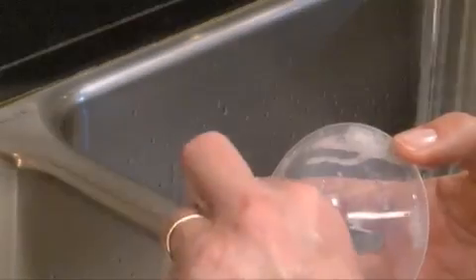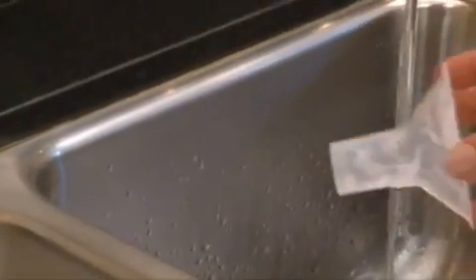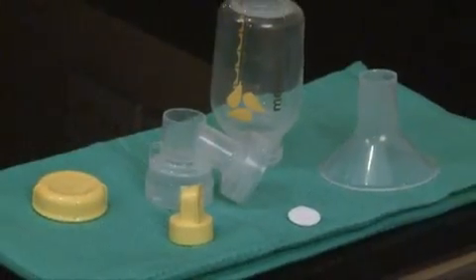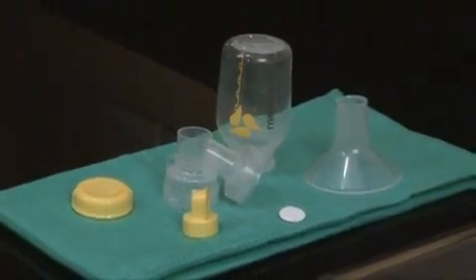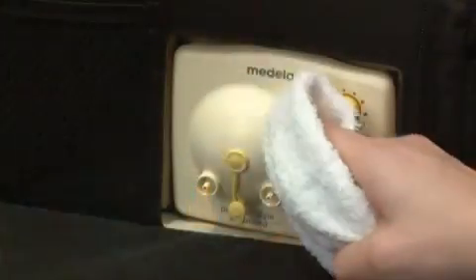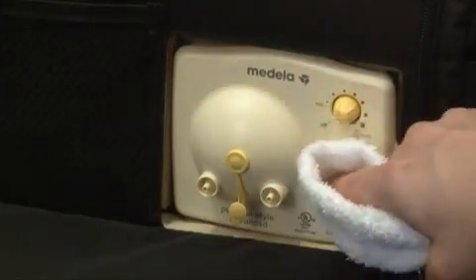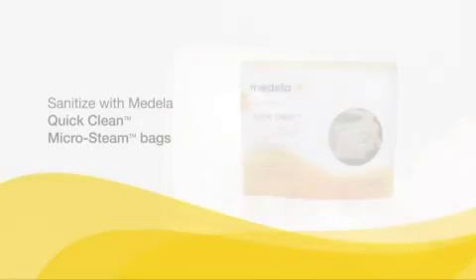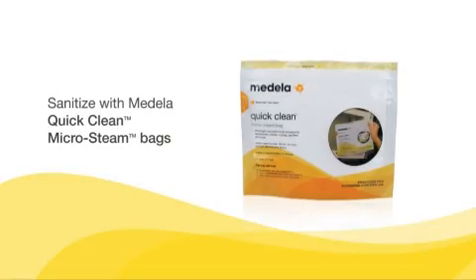Then fill the sink with warm soapy water. You may use a mild dish detergent and allow parts to soak for 5 minutes. Wash all separated parts with a clean dishcloth or a soft brush and rinse in clear water. Allow parts to air dry in a clean area and store dry parts when not in use. Use a clean damp cloth to wipe the bag and faceplate of the breast pump after each use. In addition to cleaning, you can sanitize by using Medela's Quick Clean Micro-Steam bags for daily breast pump kit disinfecting.